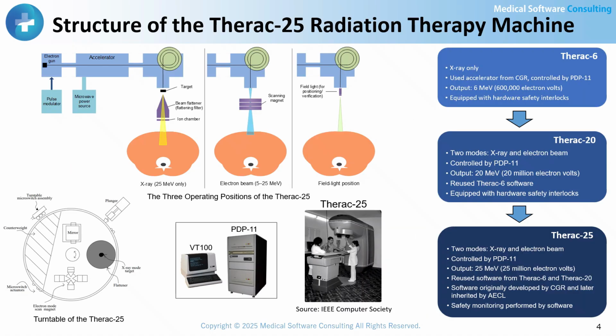The Therac 25 was a radiation therapy machine designed to deliver high-energy penetrating radiation deep into a patient's body, destroying cancer cells while minimizing damage to surrounding healthy tissue. From its treatment head, it could deliver 2 types of radiation: electron beams, beta particles, and X-rays. To generate penetrating X-rays, a stream of high-energy electrons was directed onto a metal target.